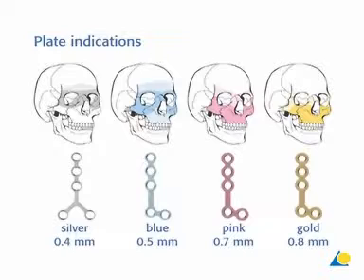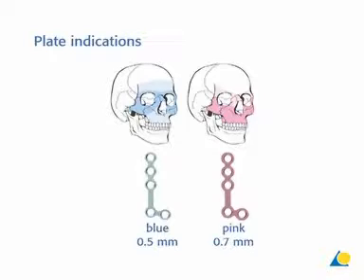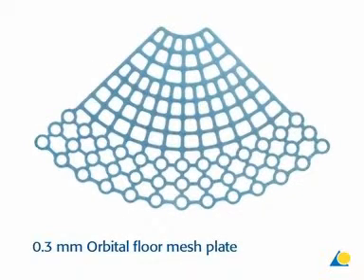The matrix mid-face system is used with all mid-face trauma indications. The plates are color-coded to indicate their thickness. In this exercise, the blue 0.5 mm thick and the pink 0.7 mm thick plates will be used. There is also a range of orbital floor mesh plates; here, a blue 0.3 mm thick plate is used.